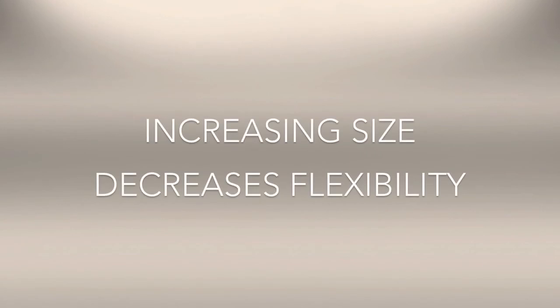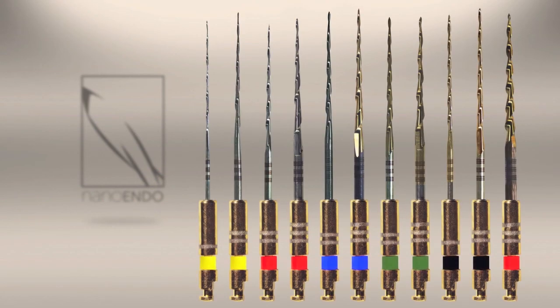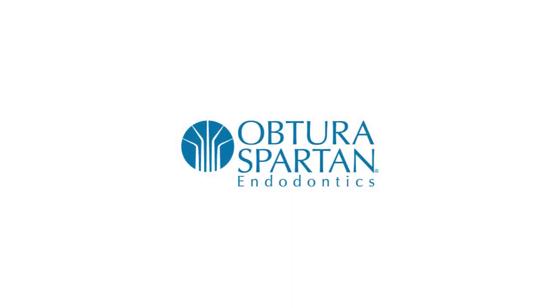Conventional files suffer from the unfortunate fact that increasing a file's size ultimately decreases its flexibility. For that reason, NanoENDO employs a progressive heat treatment technique applied only to 1ENDO file sizes 30 and larger. This unique application ensures all 1ENDO files retain excellent strength and flexibility. Additionally, 11 available sizes in the 1ENDO file series ensures you'll find an appropriate size for any technique. Just choose the 1ENDO file size closest to what you're already using and anticipate better results.